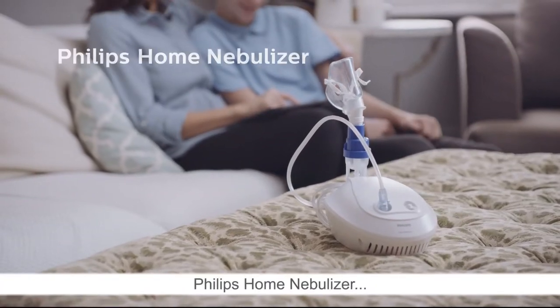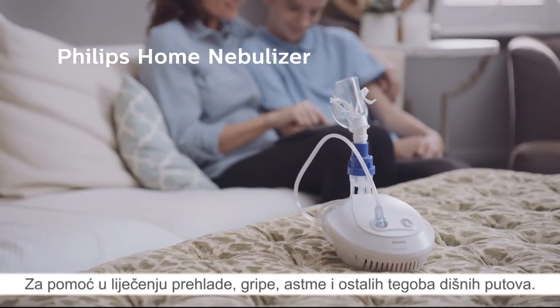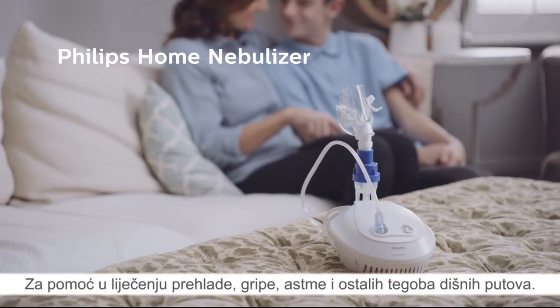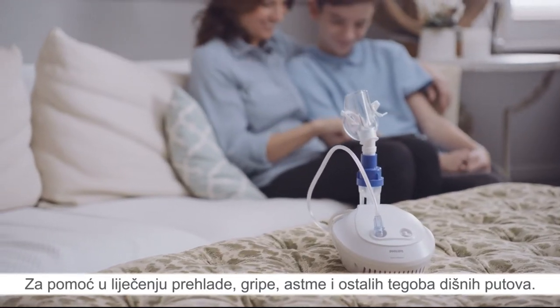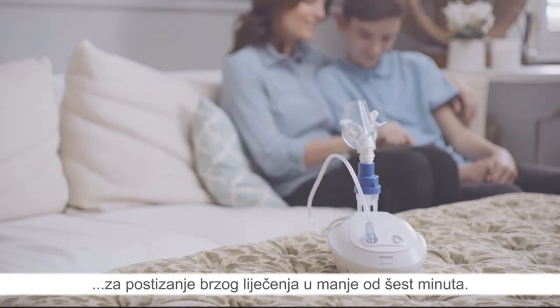The Philips Home Nebuliser gives you affordable aerosol therapy from the comfort of your own home to treat colds, flu, asthma and other respiratory conditions, with Philips' highly efficient Sidestream Nebuliser to provide a fast treatment in as little as 6 minutes.